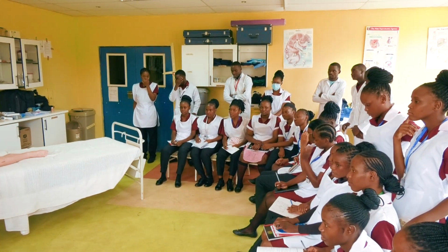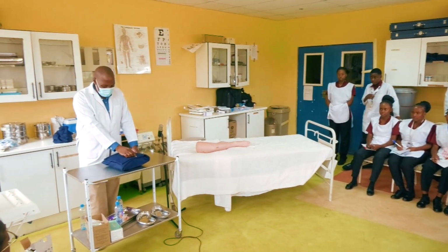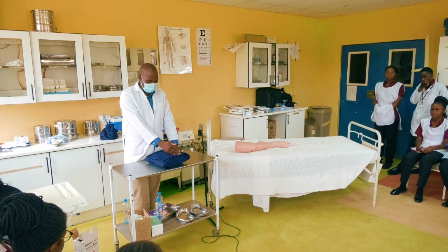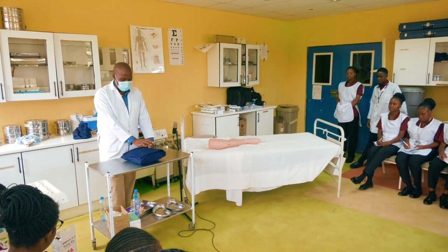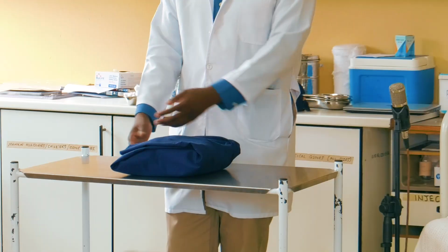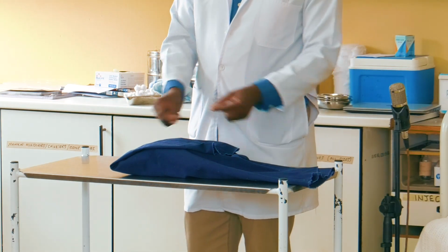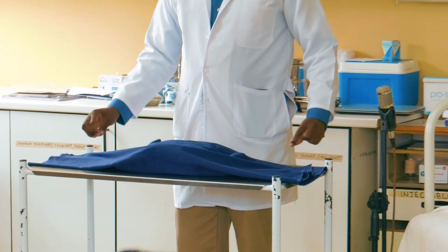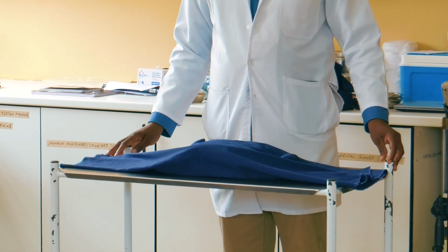If you are being assessed, you will tell your assessor that this tape was cream white before it was taken for sterilization, now it is dark brown, then the date indicated here is within 14 days, so it is still a sterile pack, right? Okay, let's open our sterile pack. Usually this will have something tight here. So opening, we don't cross over. That's the emphasis that we make when we are talking about it.